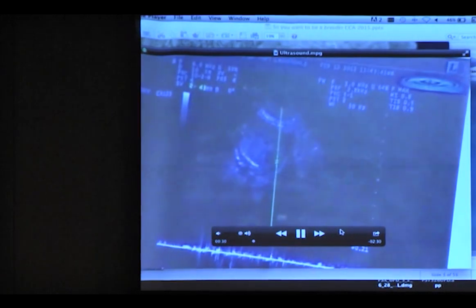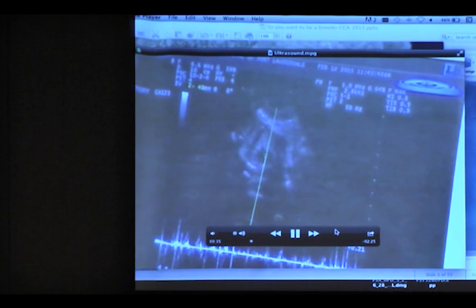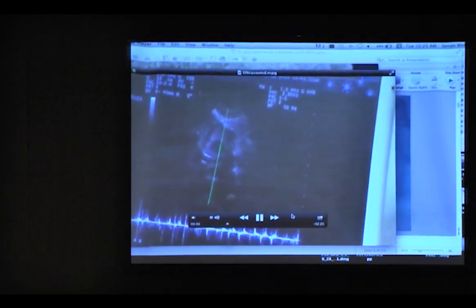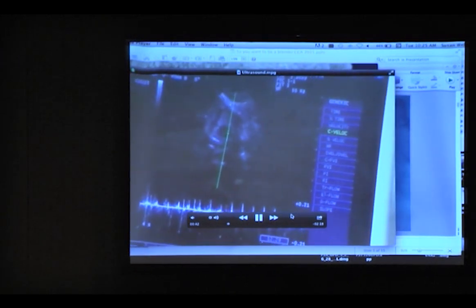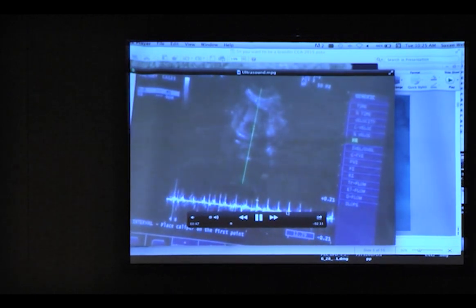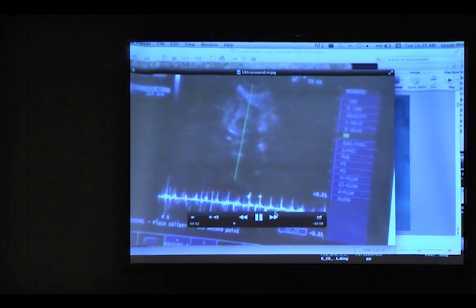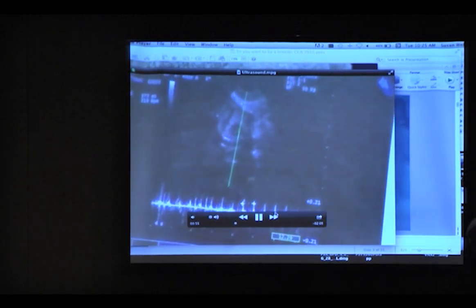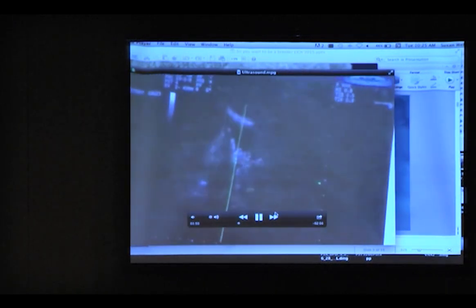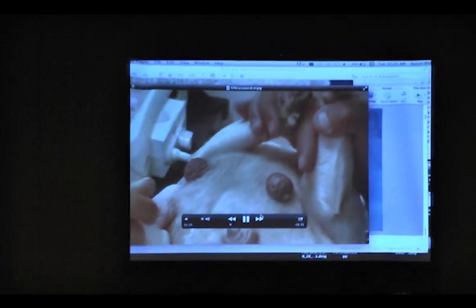And actually what we do is we count the heartbeats, because the normal heartbeat for a puppy should be well over 200 if they're healthy. So we go ahead and we run it, and we do a couple of runs just to make sure. But the normal puppy heart rate should be well over 200. If you're getting before delivery and your puppy heart rate goes down to below 150, then you're in trouble.